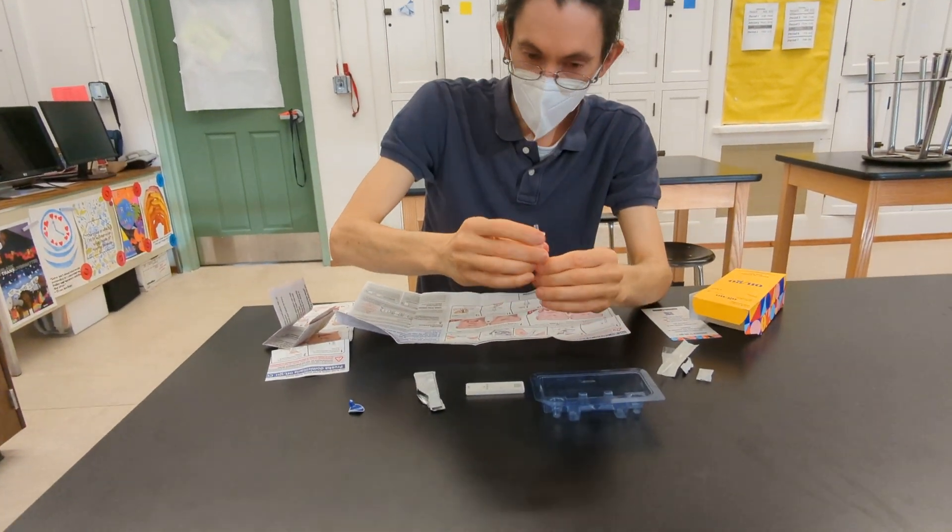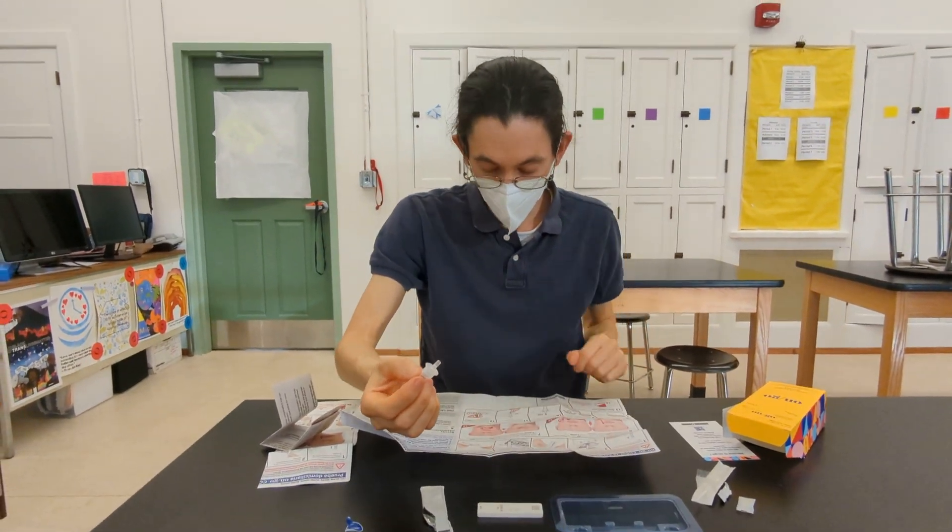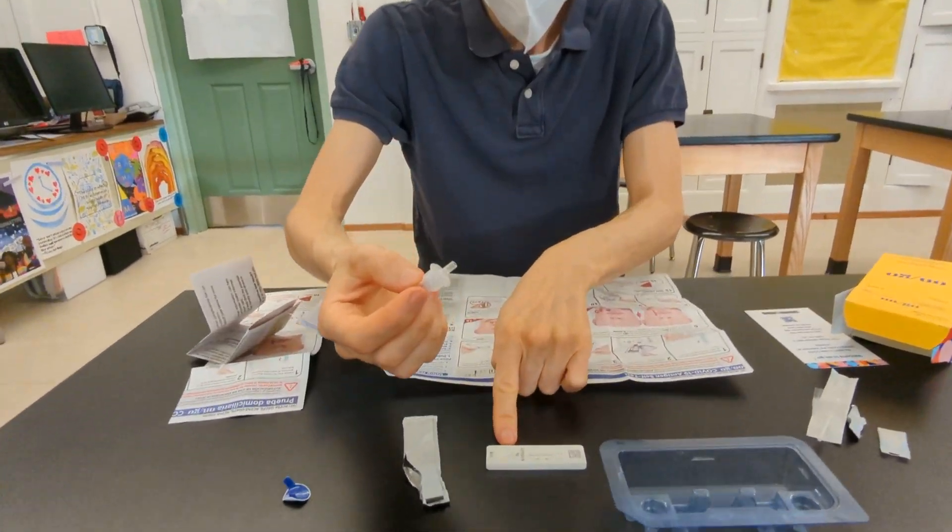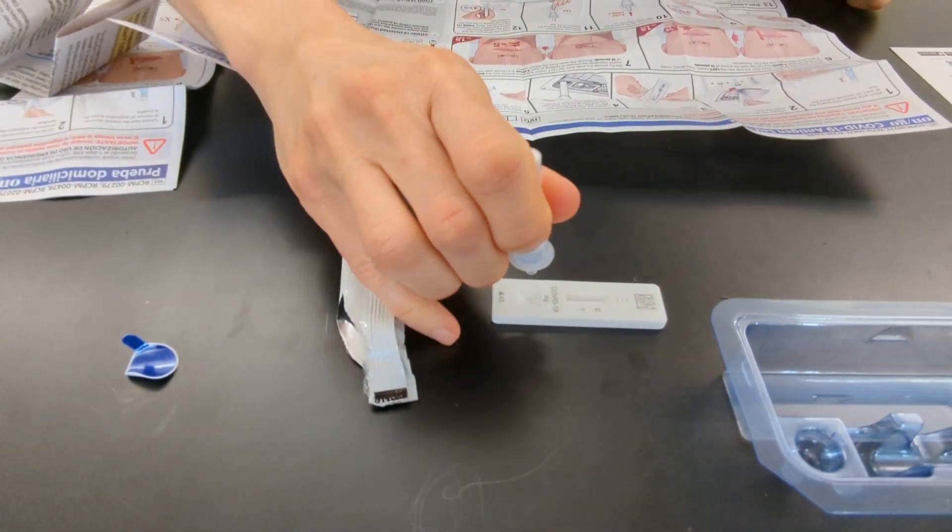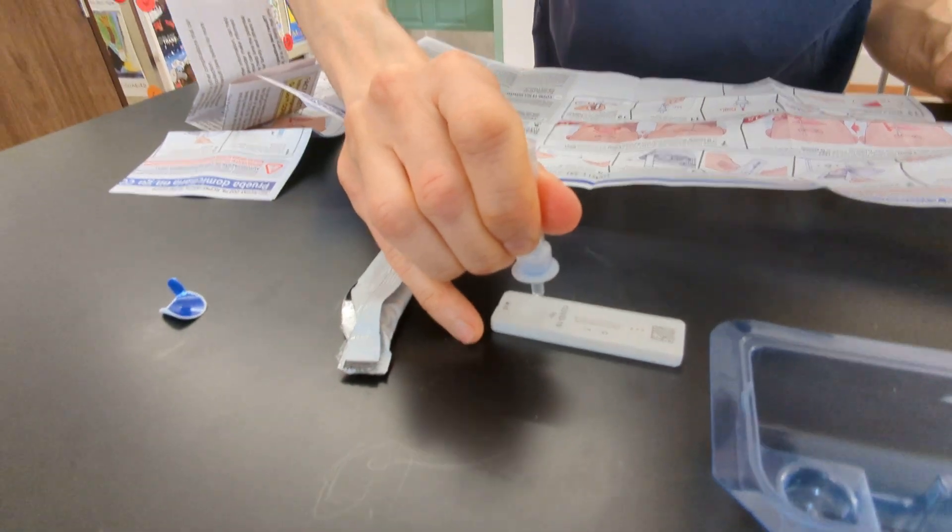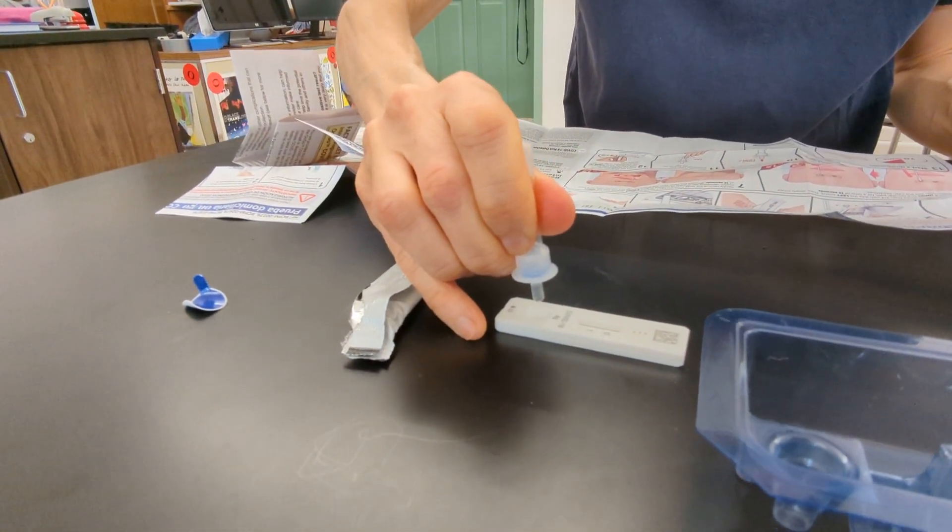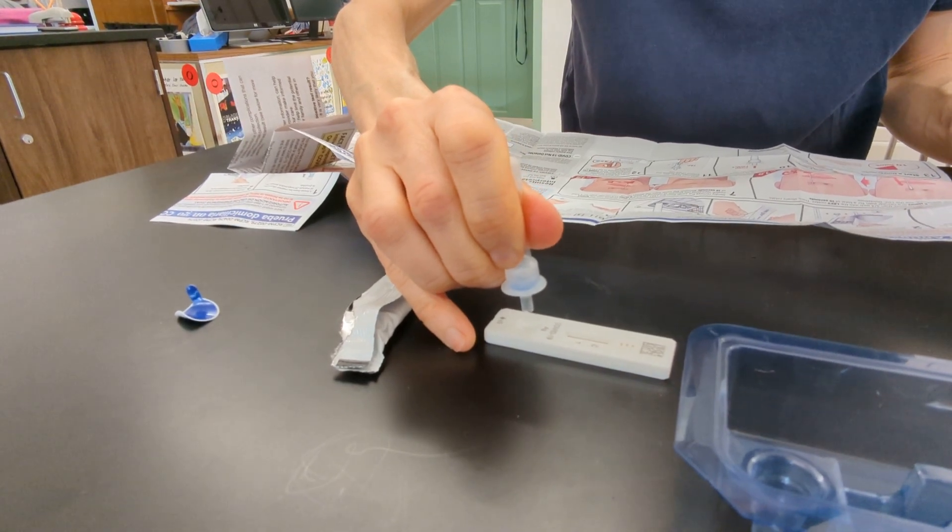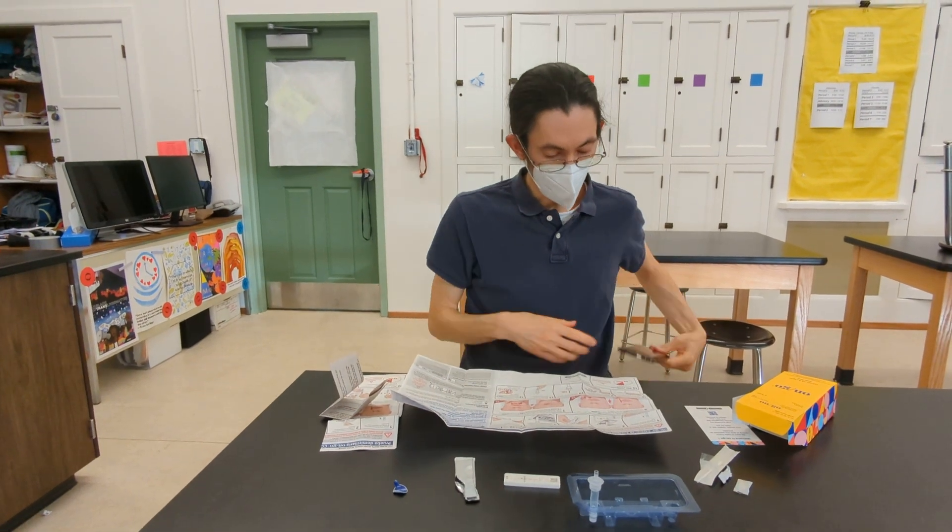Once you've done that, you're going to invert the extraction vial and place three drops in the test well. So let the drops fall freely. You don't want to touch the container to the test well.